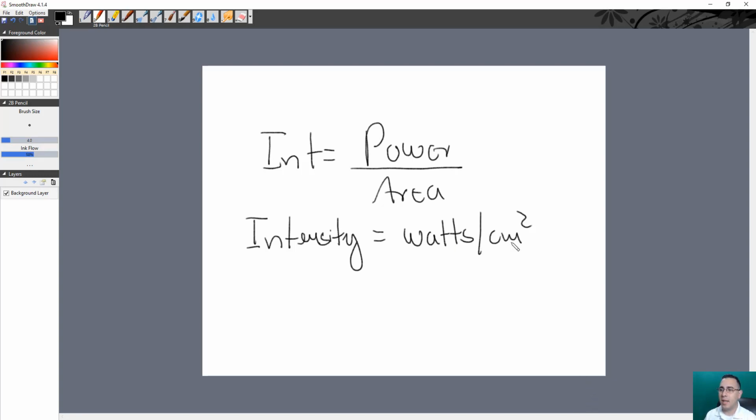All right, so intensity is something that we measure along the sound beam. And this is the sound beam in here. It looks in the space this way. It has one part that we call the focal point right here. And this is the highest intensity area.